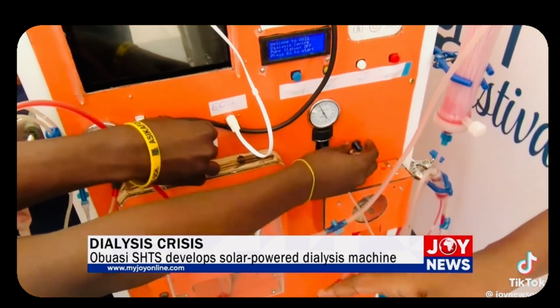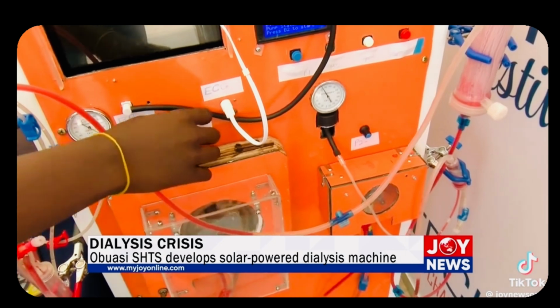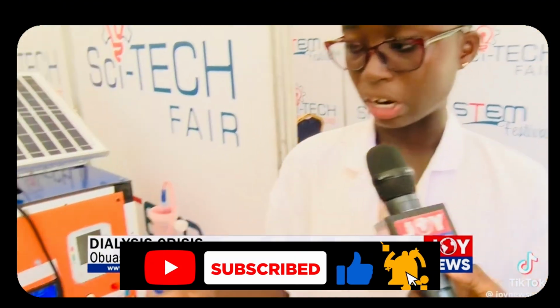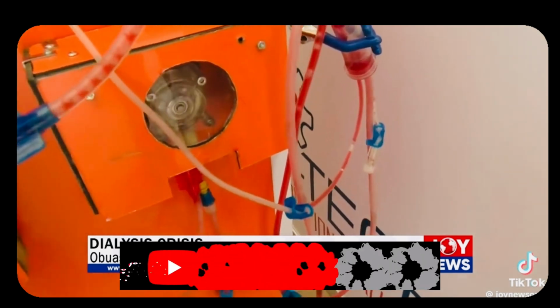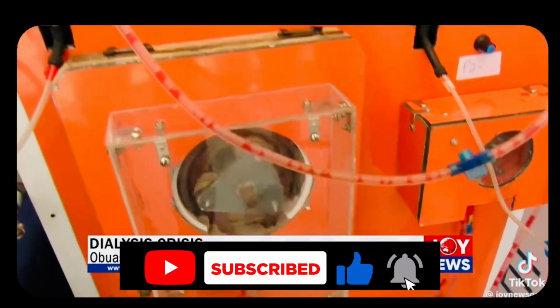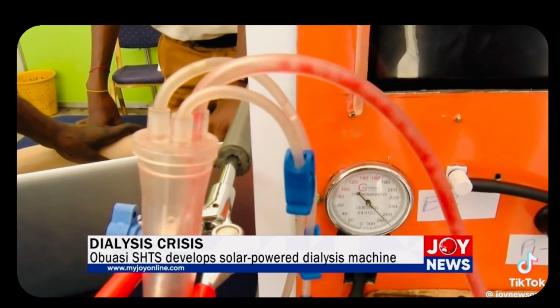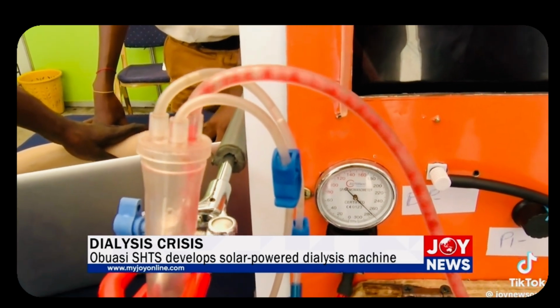And this is the dialysis treatment. Blood is taken from the patient. First, a vein and an artery are connected to form a fistula, to give the patient a firm grip, because a lot of pressure is needed to take the blood from the patient and go through the whole process. The red tubes take the contaminated blood from the patient, and then the peristaltic pump works under the principle of peristalsis. We have flexible tubes that contract and then relax to provide the right pressure for the fluid to flow through.